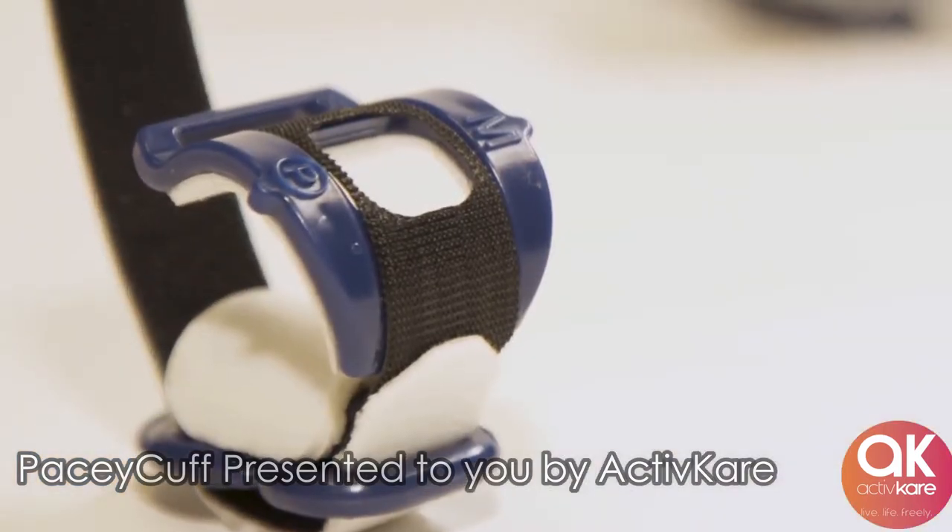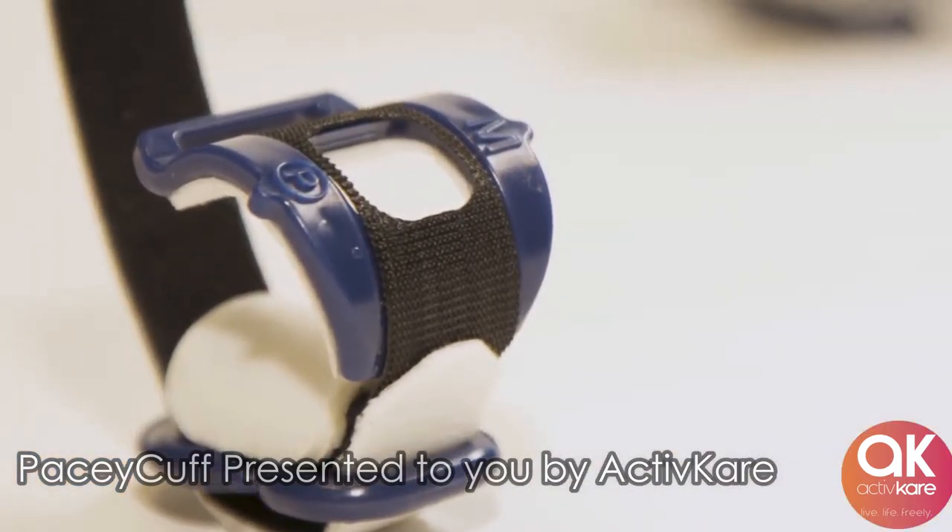The fenestrated hood of the Pacey Cuff protects the circulation. This ensures the blood flows without limitation.